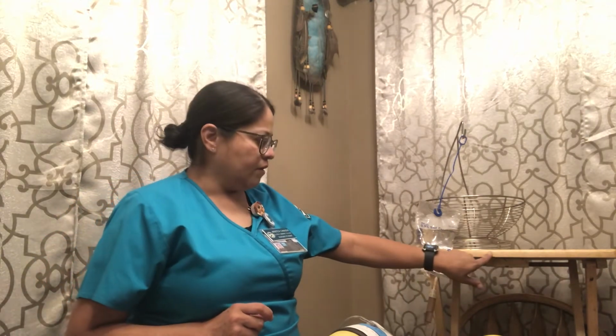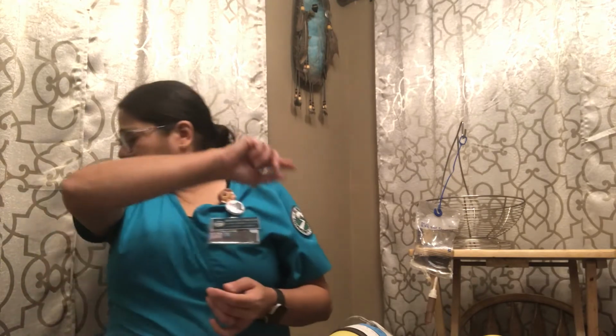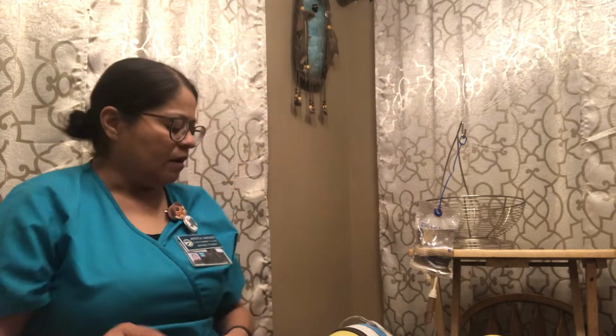So now we are getting to do IV medication, but it is a non-compatible solution. So for the non-compatible solution, we do need to pause the machine. So we're going to go ahead and pause the machine. I've already assessed pain. I've assessed the IV site, allergies to medication. I've identified the patient using 2 patient identifiers. I've also washed my hands and made sure to verify the electronic record.